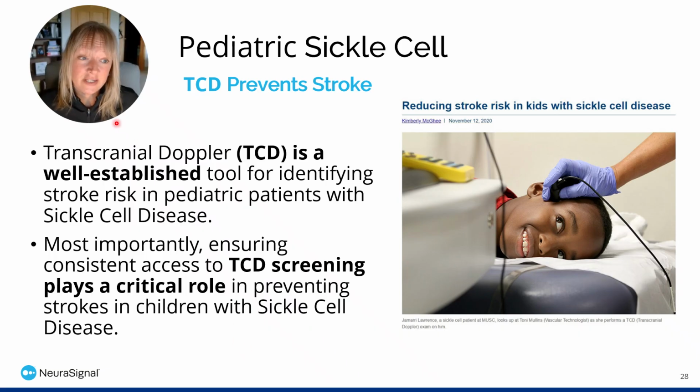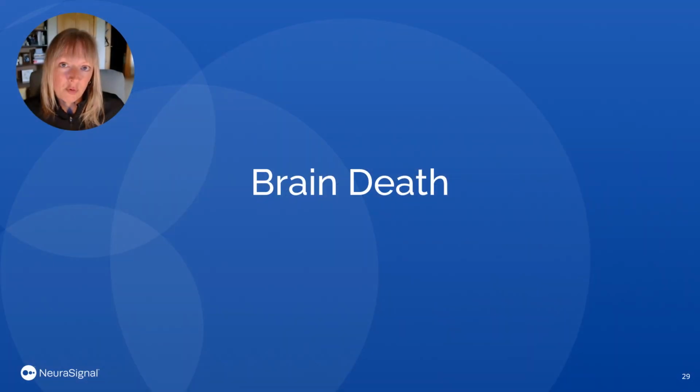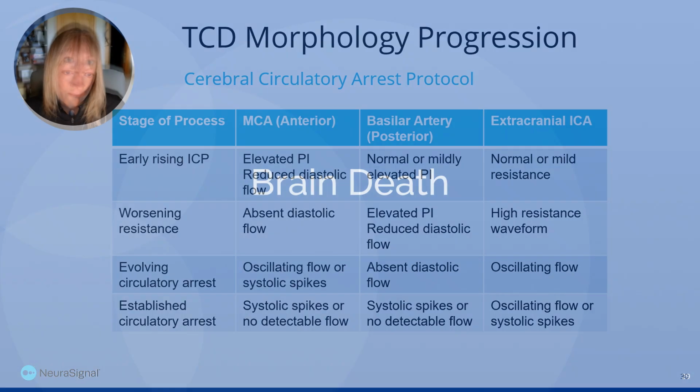As we know, TCD is well established for identifying the stroke risk in our pediatric patients with sickle cell. So we need to ensure TCD is part of the process of providing the best patient care for our sickle cell pediatric population. And moving right along into brain death.